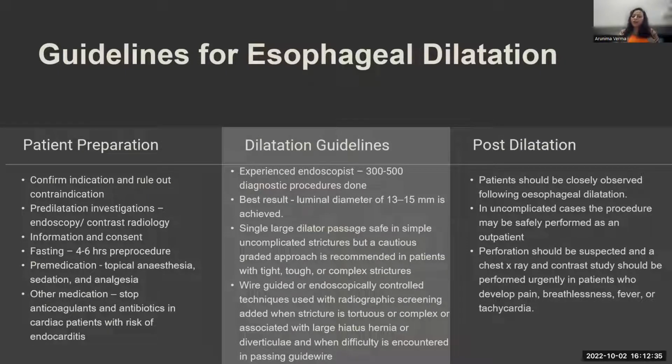Anticoagulants: if the patient is on anticoagulants, do stop them 5 to 6 days before the procedure, and they can be restarted 5 to 7 hours after the procedure. Antibiotics should be considered in patients who are at risk of endocarditis.